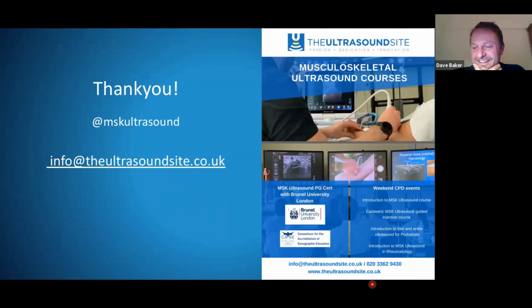So thanks very much, Guy. Hopefully that was useful and interesting to you all. So an overview really of just some of the structures that you can see on musculoskeletal ultrasound. So yeah, have a look.